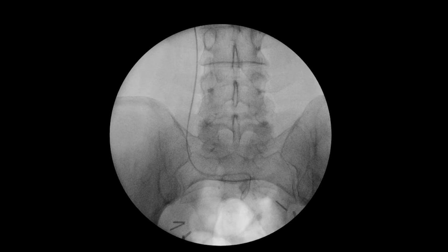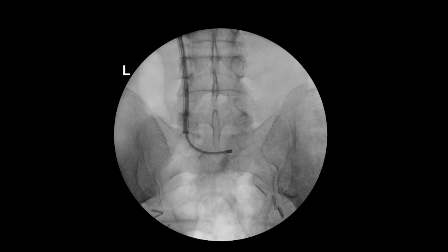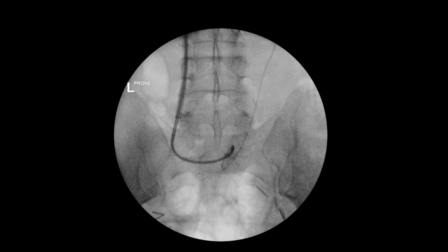You can see here now the patient is turned prone, and we're trying to pass a wire out into the conduit. You can see that we've got our access sheath all the way down to the lower ureter, and then we've got a flexible ureteroscope down there, having a look and trying to see if we can access the stones which we saw.